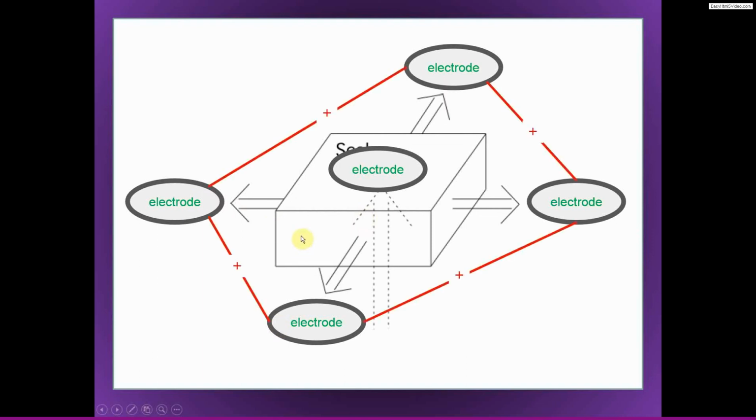So what we can do is sum all of these electrodes, or take the average of these surrounding electrodes, and subtract that average from the activity at each individual electrode. This is fine. This was the old school method of doing CSD, and it's called the Hjorth method, I think from the late 70s or maybe even earlier. So that's okay. This is like a poor man's Laplacian.